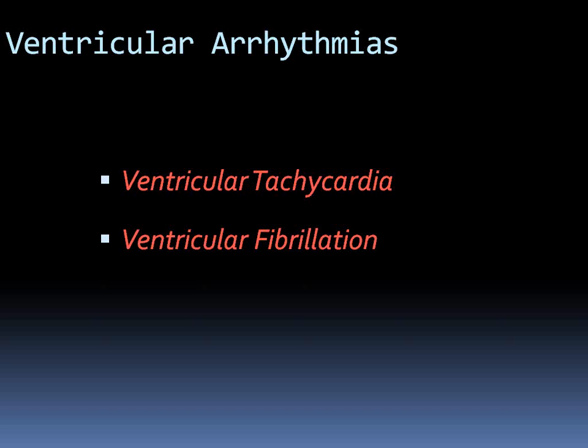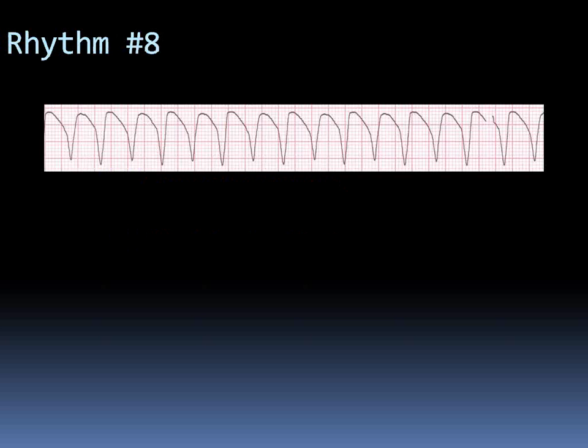It really does not matter if you miss LVH, or left ventricular hypertrophy. It really does not matter if you miss axis, whether it's superior axis, inferior axis, left axis deviation, or right axis deviation. The most important thing for you in cardiac rehab is arrhythmias, recognition of acute MIs, and even more important than that, seeing if the patient is hemodynamically stable or not.